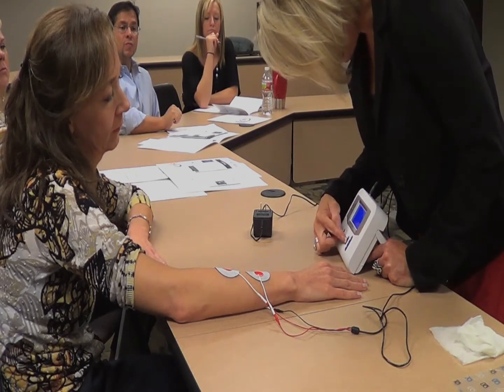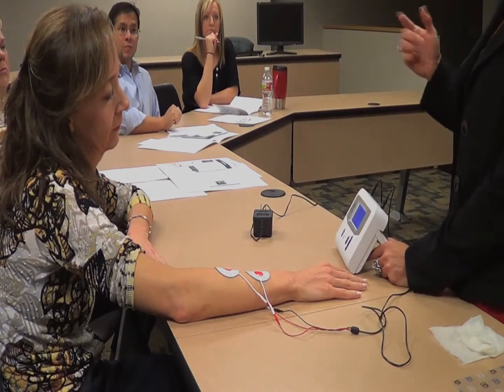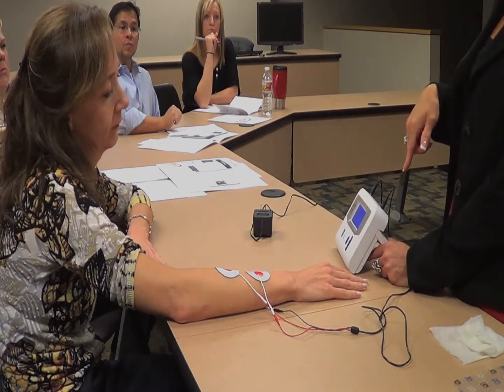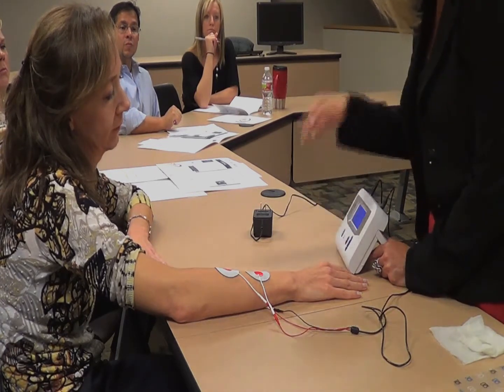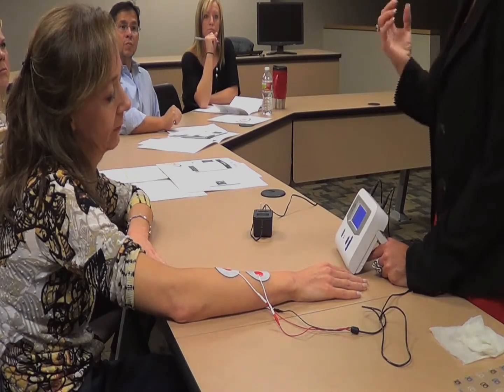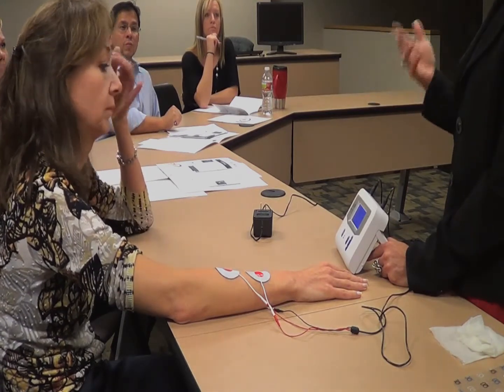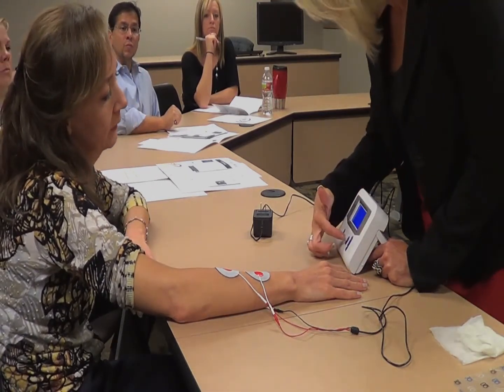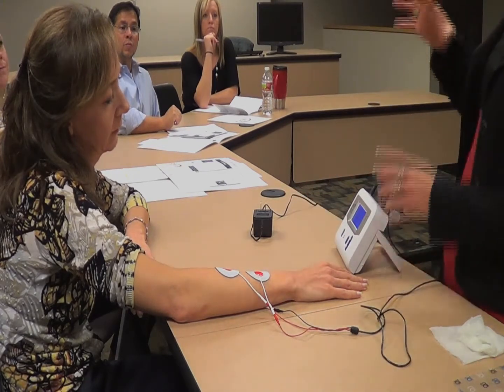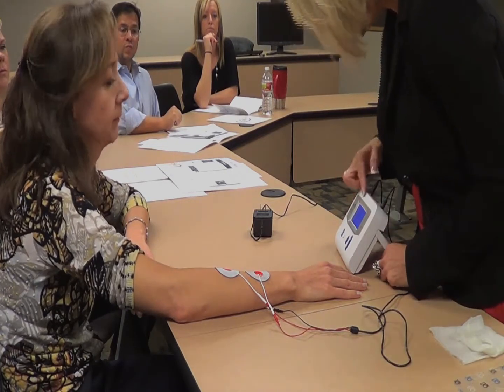Oops. Somehow I jumped. Here's where the audio is. You can turn the audio on or off. Hitting it again gives you compliance data. So if I hit the arrow, because it's showing you an arrow, that tells me 16 hours, 20 minutes, and it's been used 23 times. So if you were checking on a patient to see what their usage was, that's where you would do it. And then you hit the program button one more time, and it's going into the mode of where you do the therapy. Okay? So now we have to set the stim.